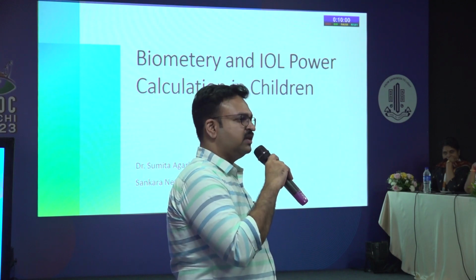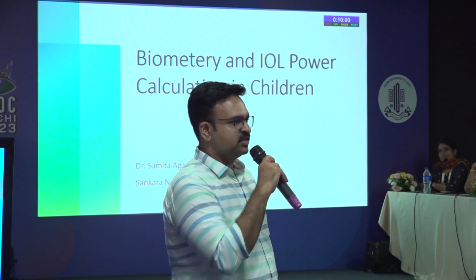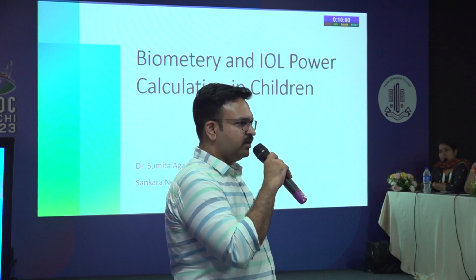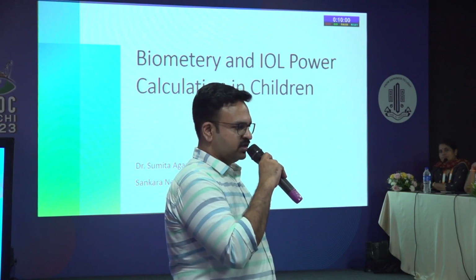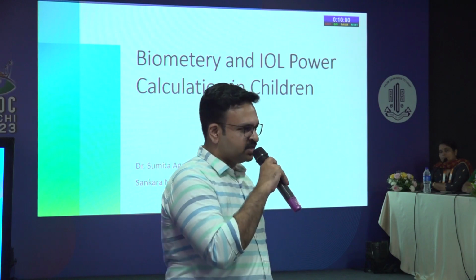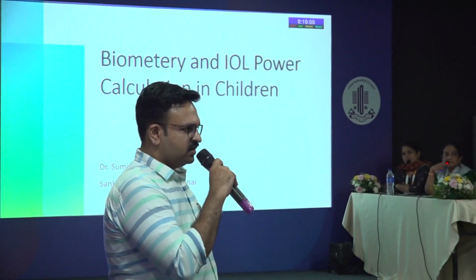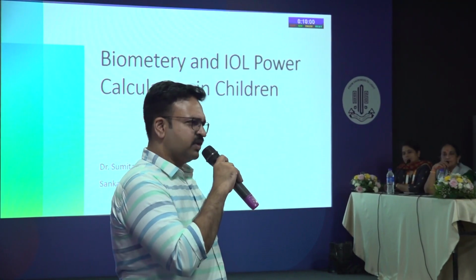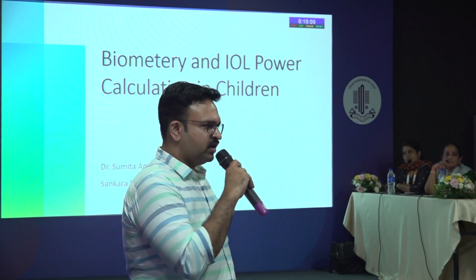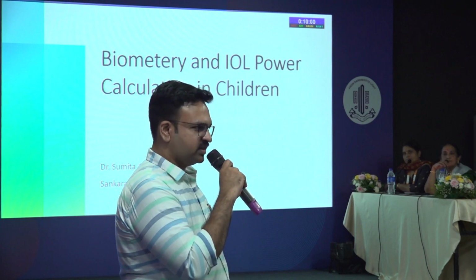So that is more beneficial to the baby, beneficial to the surgeon, beneficial to the anesthesiologist as well, because you are controlling everything and you have the adequate values shown on the monitor. When you are hand ventilating, all the things are guesswork. The pressure you are giving, the sampling rate, the temperature, the oxygen level, everything is guesswork. But when you are connecting to a ventilator, all these are correctly monitored.